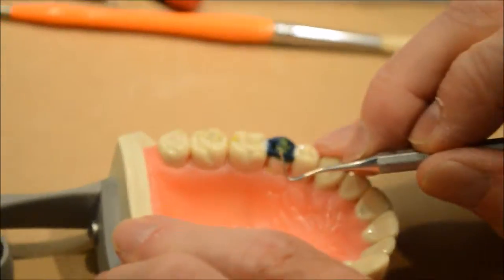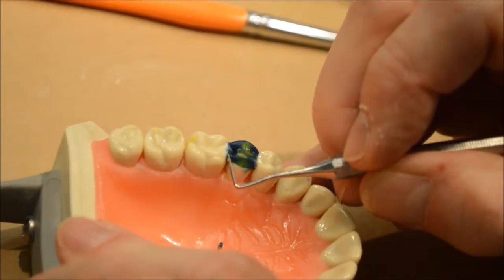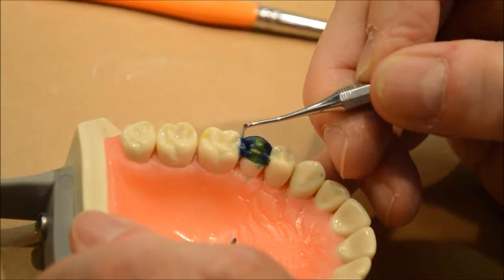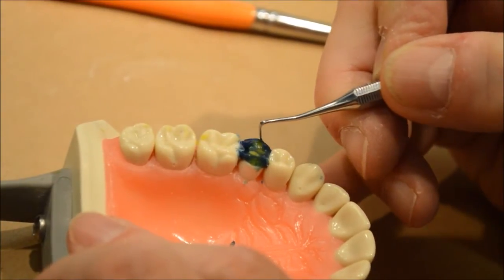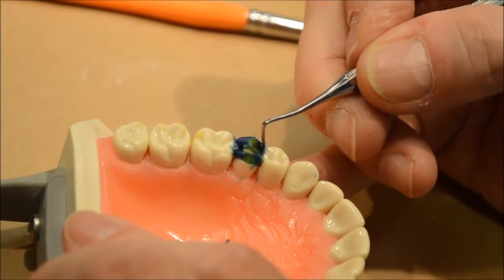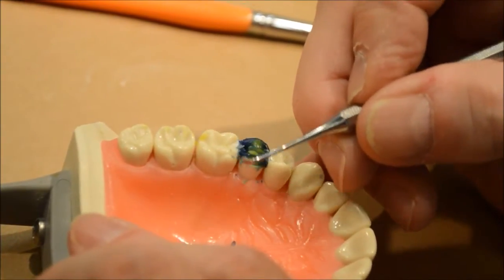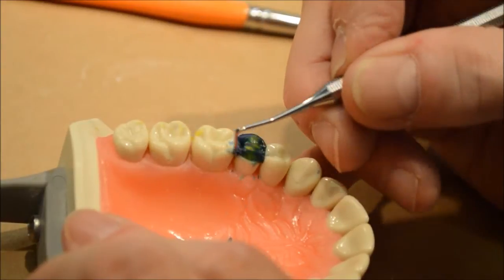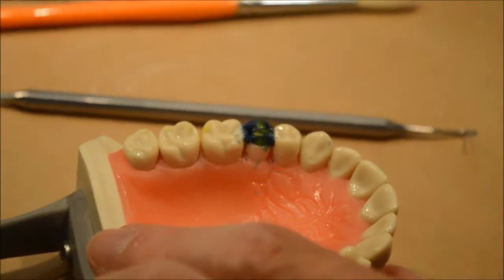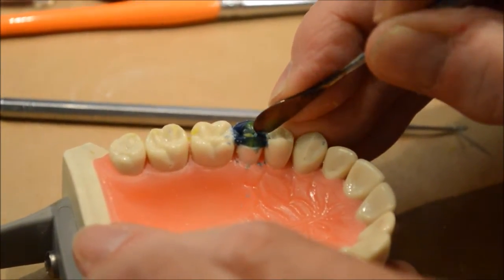Now I'm going to take and open up these embrasures. There's a rule in waxing and whenever you're doing restorative work that marginal ridges should be the same height as adjacent teeth. So what I'm going to do is take the number seven wax spatula and put part of it on the adjacent tooth and part of it on the wax and just go back and forth to make it so that they're the same height.